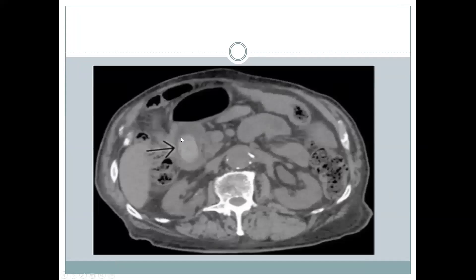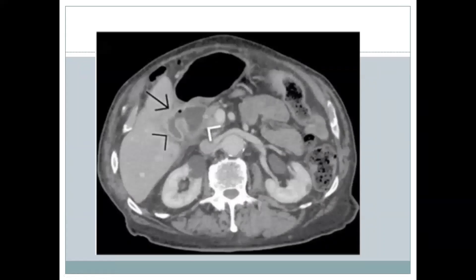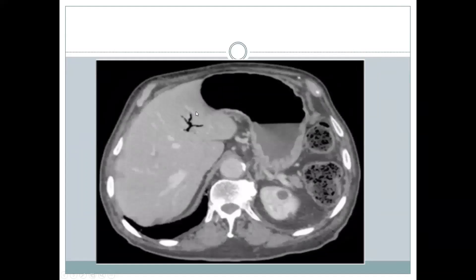Another image shows the duodenal bulb with a slightly less radiodense gallstone. The shrunken gallbladder is also visible, along with the duodenum, the fistulous communication between the two, and pneumobilia.